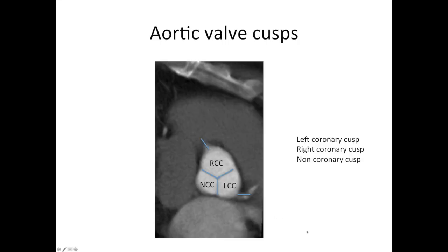A word on the naming of the aortic valve cusps. This is the aortic valve with its Mercedes-Benz sign. Coming off this side, we have the left coronary artery — so this cusp is called the left coronary cusp. Up here we have the right coronary artery, so this one is called the right coronary cusp, even though it's at the front. And this third cusp, which doesn't have any coronary arteries associated with it, is called the non-coronary cusp.